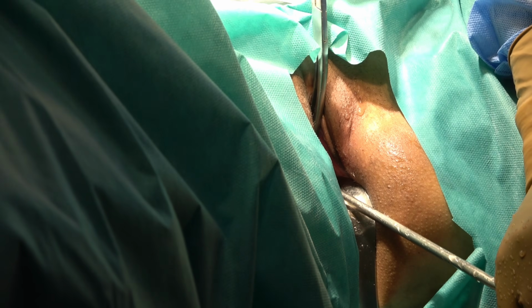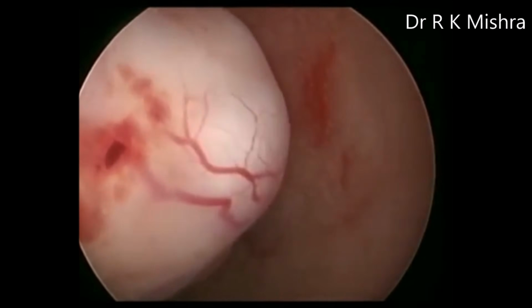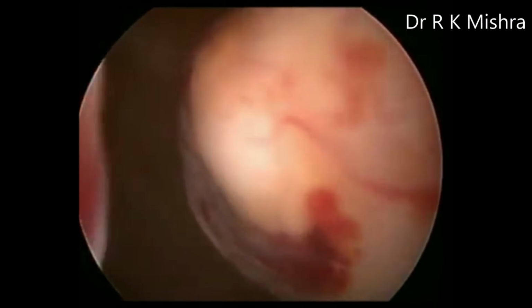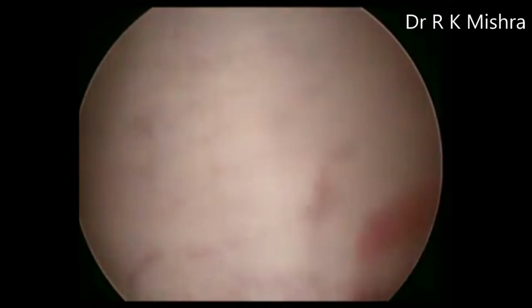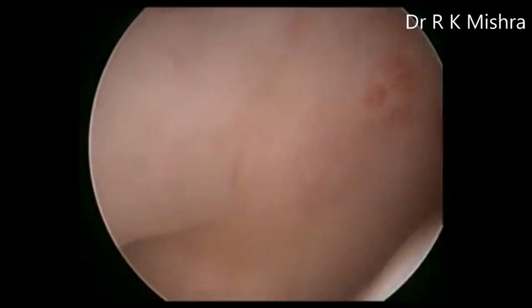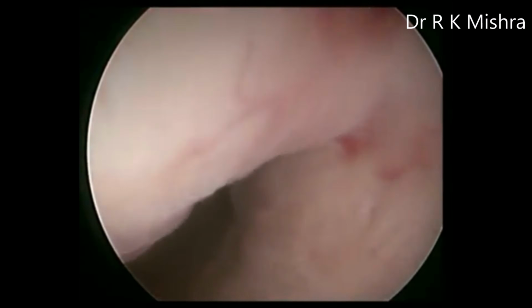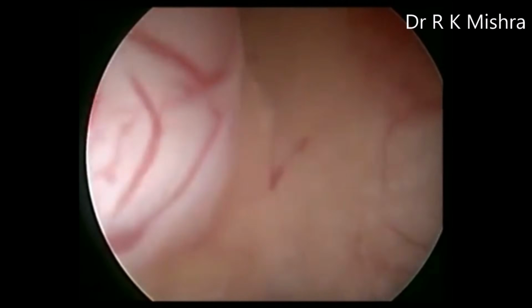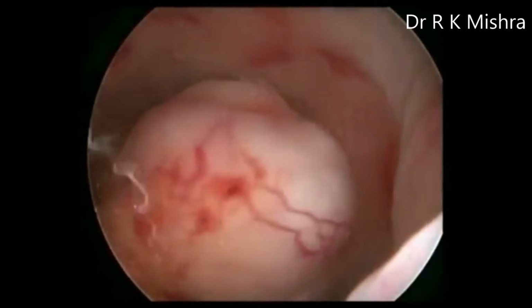Here the pressure we are using is approximately 150 millimeter of mercury, and here we can see there is a submucous myoma. Now you can identify it, and you can try to see both the ostia. If you go very carefully down there, then you can look for the ostia also. And this is the ostia of the right side, and this is the ostia of the left side. Both the side ostia are good, and it is a fully pedunculated myoma. So in those situations, you don't have to worry, you can easily cut it.